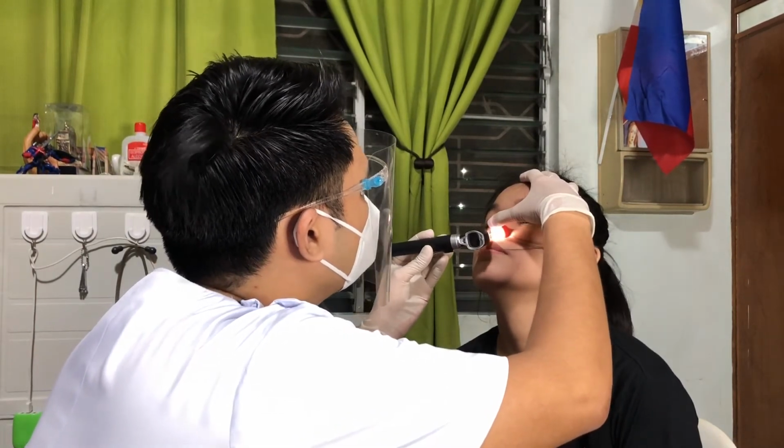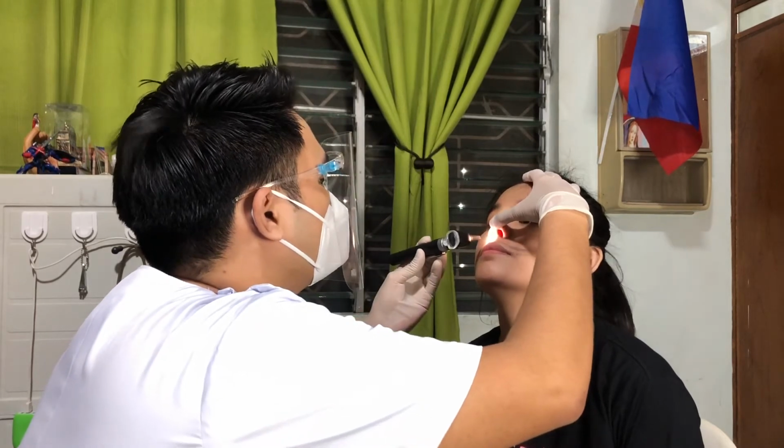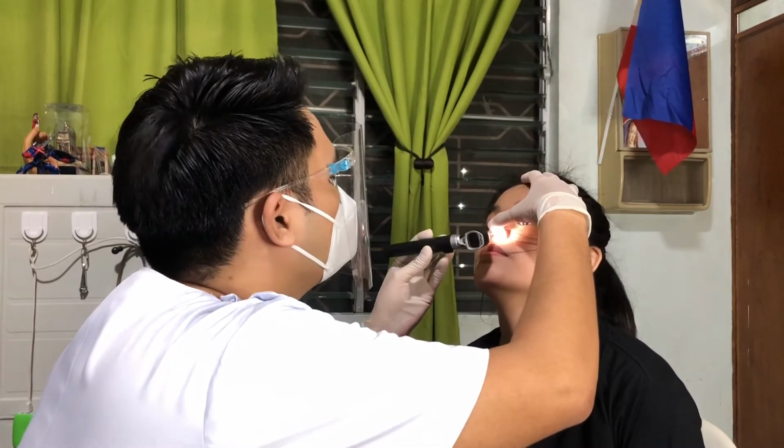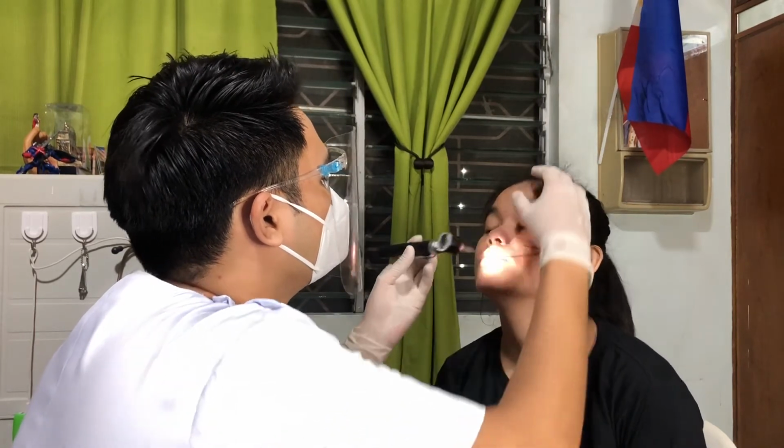In our case, we use the otoscope. Note for any septal deviation or perforation. Further inspect the nasal mucosa. Inspect further the inferior and middle turbinate.